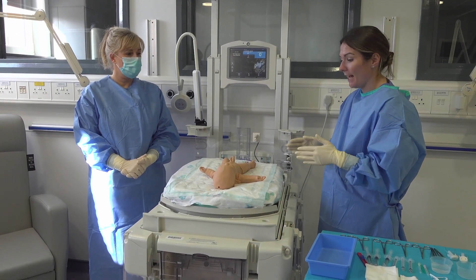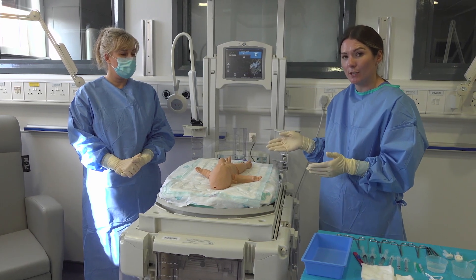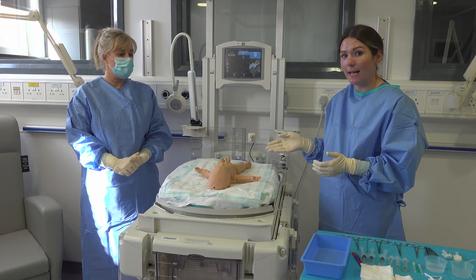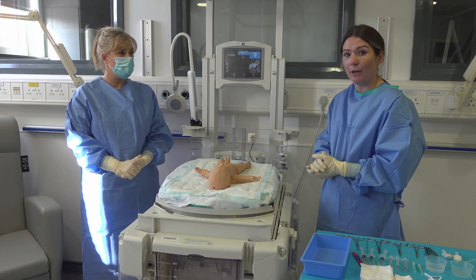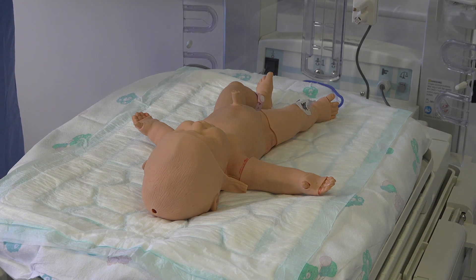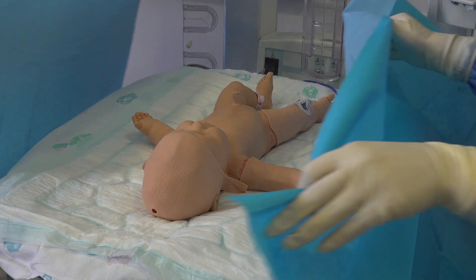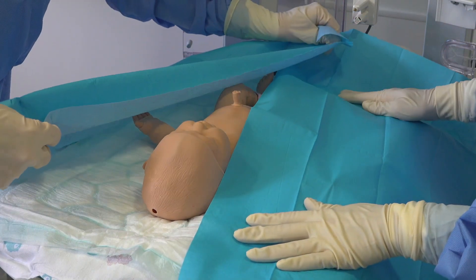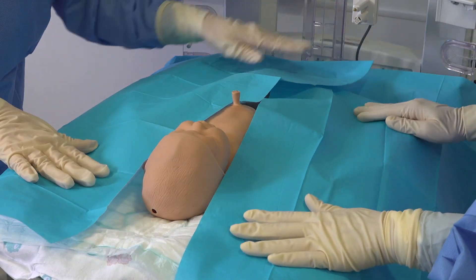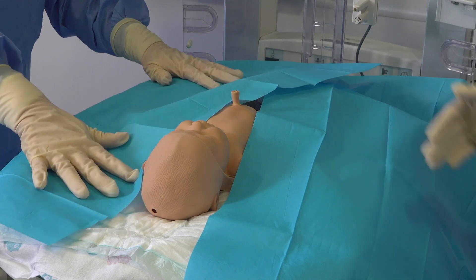Before starting I always review the baby and ensure that there's good perfusion in the lower limbs, just to compare this with the perfusion after the procedure has happened to ensure that the limbs don't look any different in colour. We're then going to put our drapes surrounding the baby, being careful to make sure that none of the sterile sides of the drape touch or get contaminated. These go on both sides to make sure that we remain sterile whilst doing the procedure.